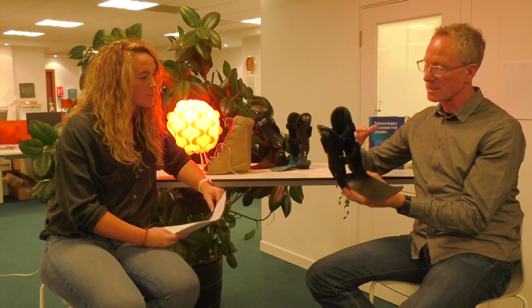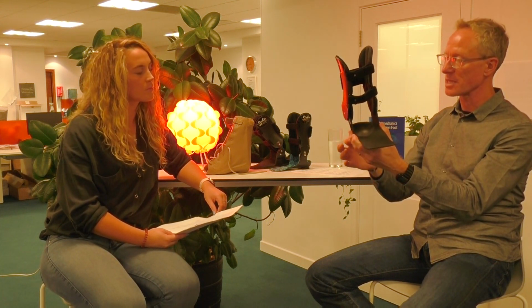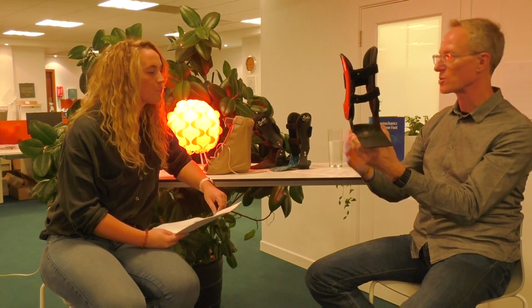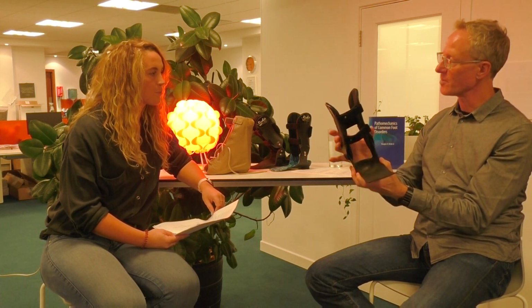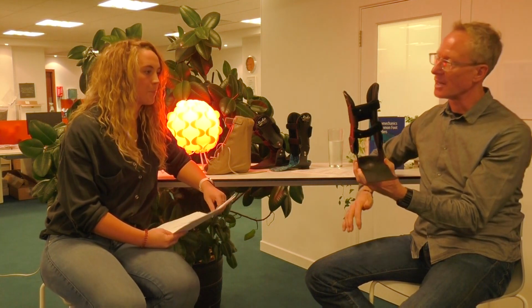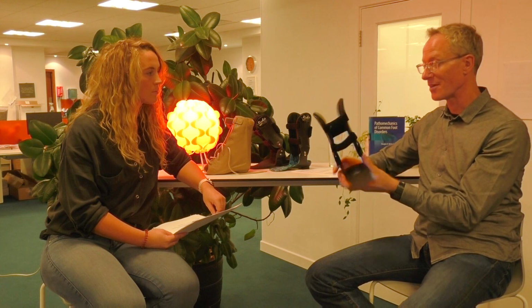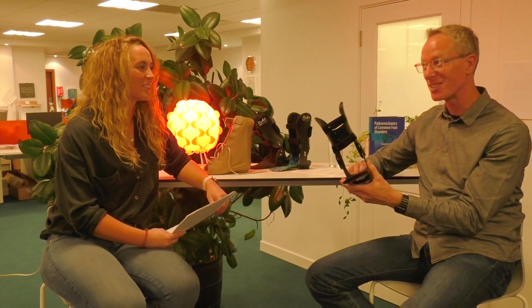Well, again, it comes back to similar concepts around orthotic design. So what you do is you lower the heel cup. So you can say, okay, let's make this heel cup 20mm. Let's make it 25mm. Let's do a forefoot cutout to narrow it. But then you still have the benefit of this support back to the ankle joint. So it's again about the design, and we have fitted these into soccer boots, and in one patient, I've actually fitted a Richie brace into a Prada low cut shoe. So it can be done.